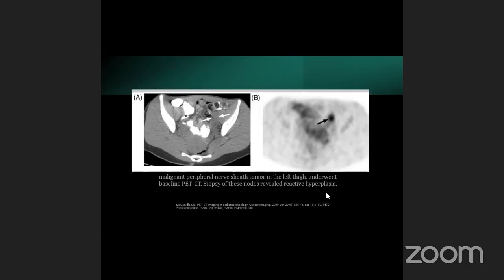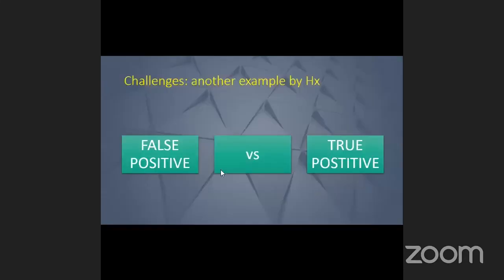So this is one of the pitfalls, that it can give you a false positive. Not everything you see, even high in the PET CT, can you say is 100% malignant. It can be, again, something false positive. So you will know this by pathology.